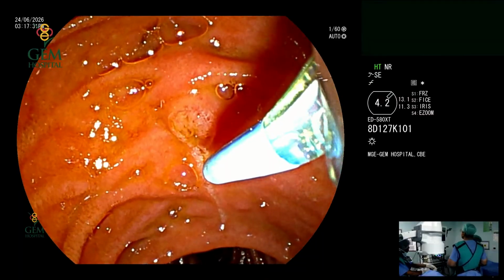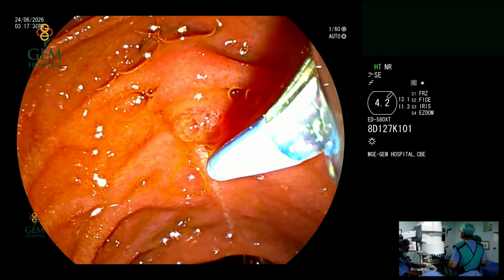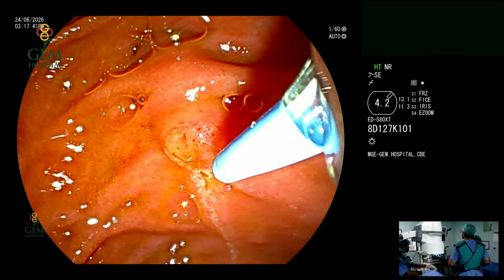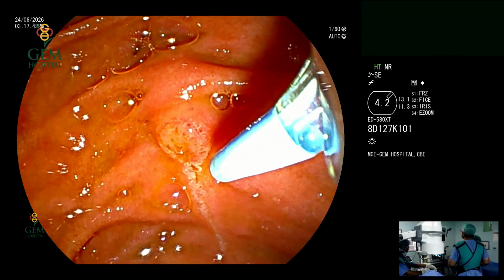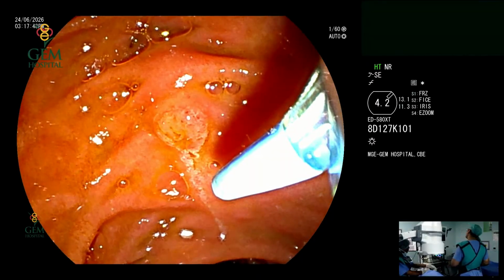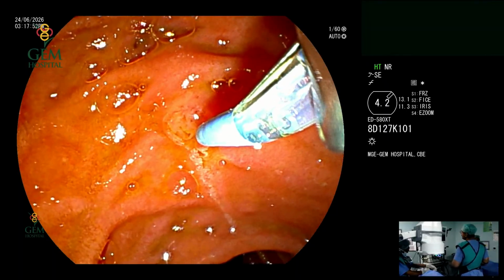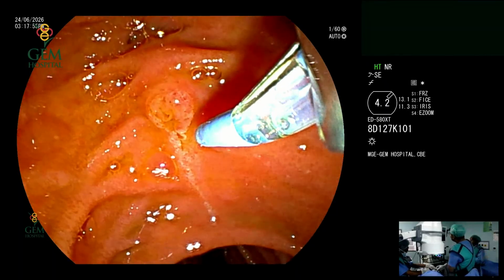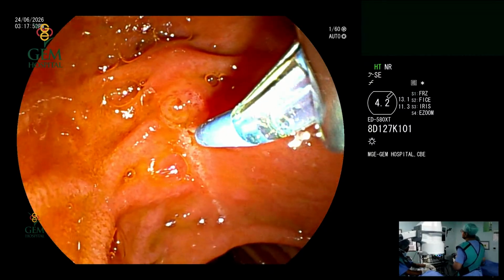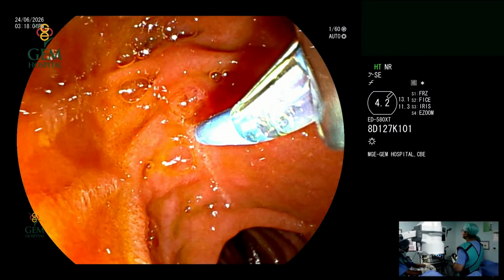First step is to identify the papillary orifice. And the papillary orifice, you can see it bulging, and you can see the opening here, and you can see a smaller opening here. So basically, a human papilla has both the bile duct, the CBD, and the PD opening up into a common papilla, right? So we need to be really sure that the cannulation is towards the CBD, right?